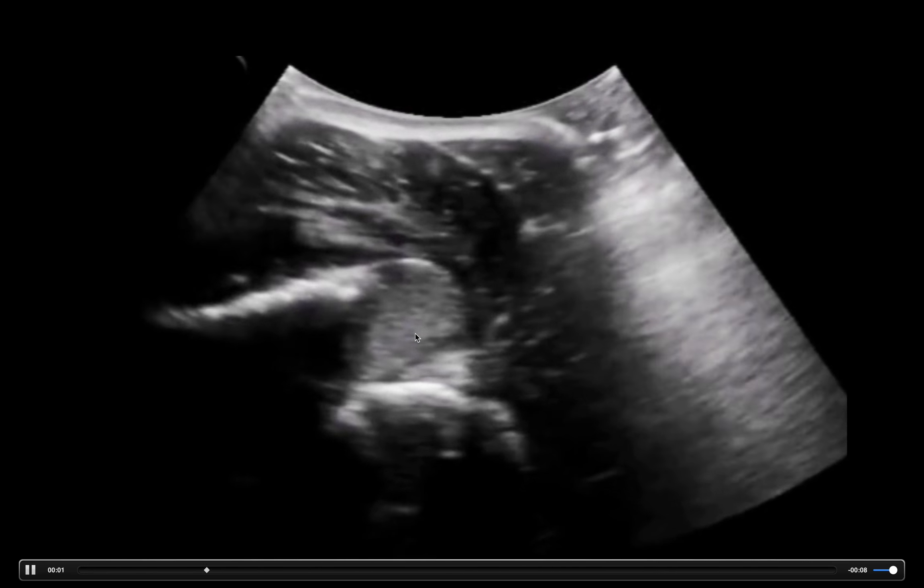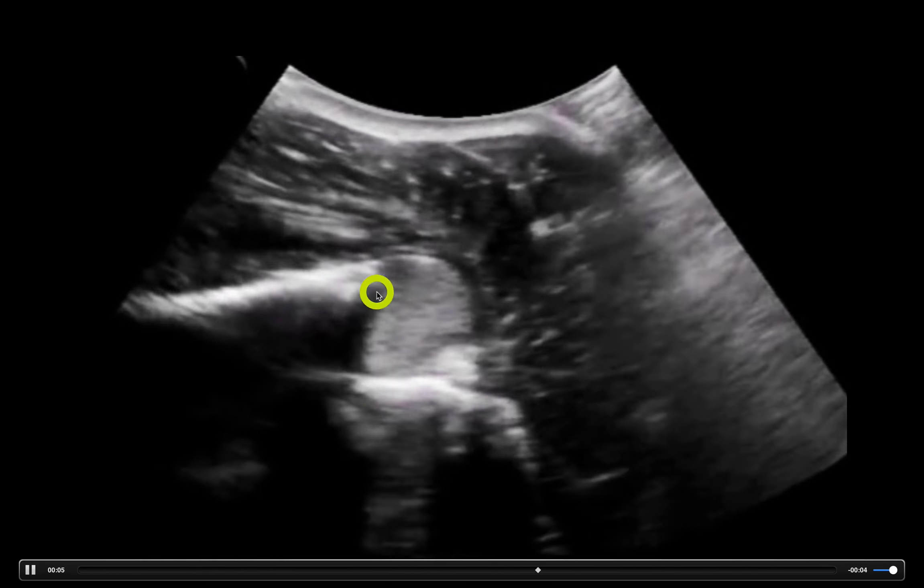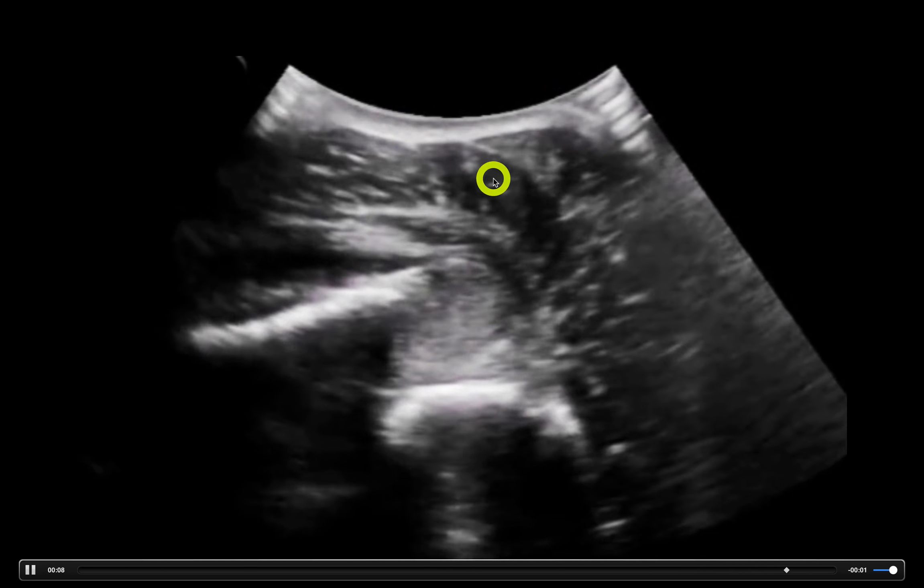This is hemorrhage due to that dislocation. I did mention this is an anterior dislocation. If this were a posterior dislocation, all you need to do is look for that humeral head closer to your probe, up here.